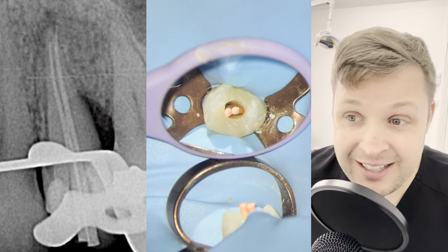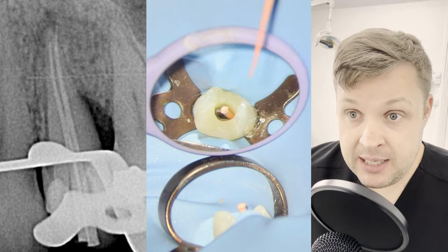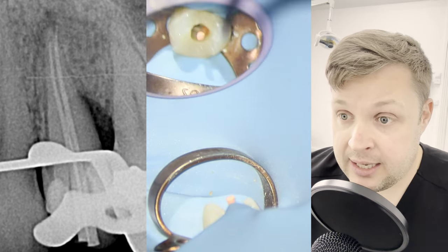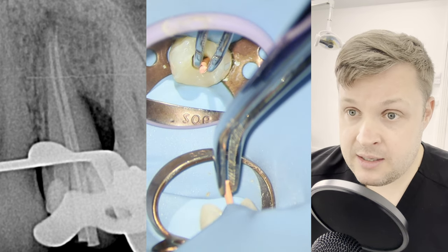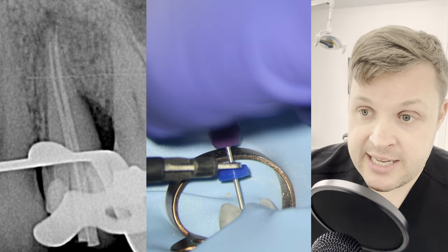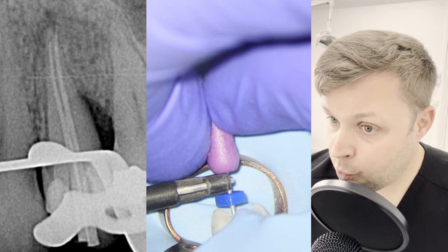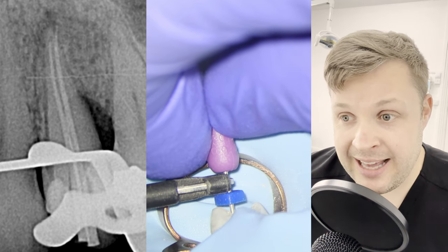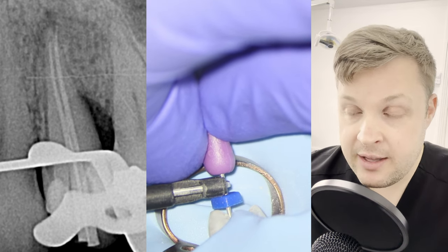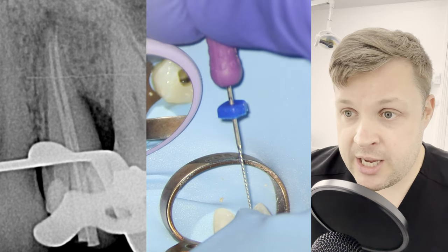We take an x-ray, and you're running on time, everything's going swimmingly, and you see this. To me, one of them looks long — there's an appearance that it's long. As soon as I see that it looks long or even short on the radiograph, I'm straight away checking with the apex locator again. When we check with the apex locator, the working length is still correct. Sometimes working lengths can be incorrect because you took the working length at the start, you've shaped the tooth, there's been a bit of a curve, and the shaping makes the working length shorter. So I'm always checking, always checking.